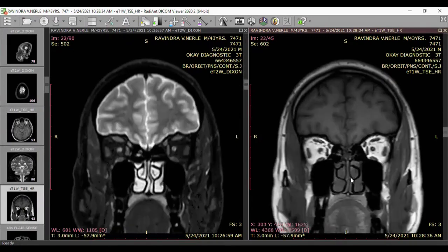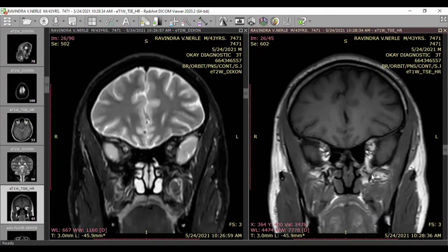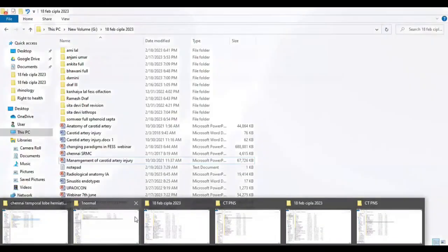Now see how to look for pterygoid bone involvement. See the pterygoid process on both sides with the bone marrow. In a normal situation, you will find this bone marrow. This is T1, where the fat in the marrow is bright. On T2 weighted, see, this is dark signal because the fat is suppressed. Got my point? Whenever on T2 weighted fat suppressed you find any enhancement, that means inflammation. That is what I wanted to tell you.